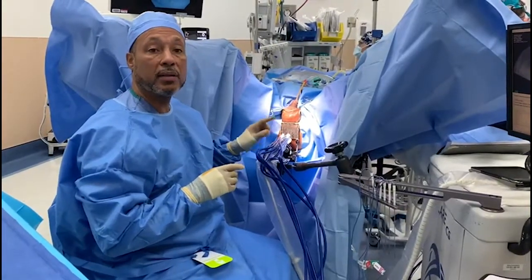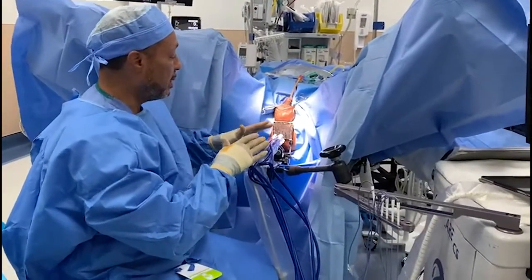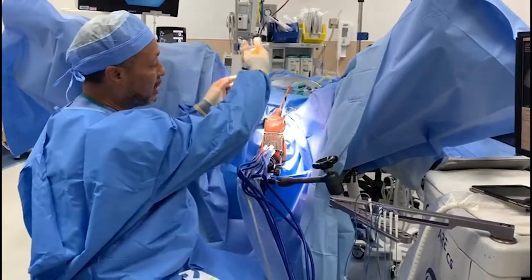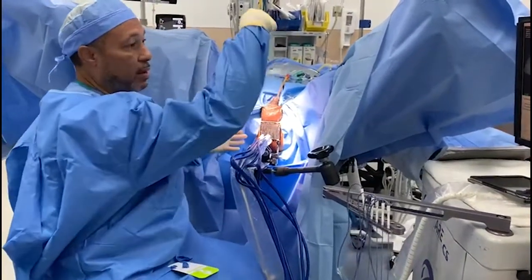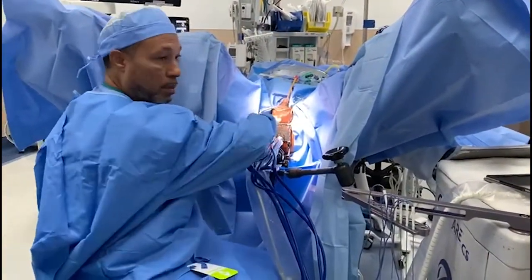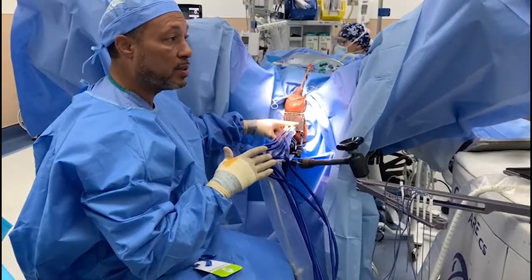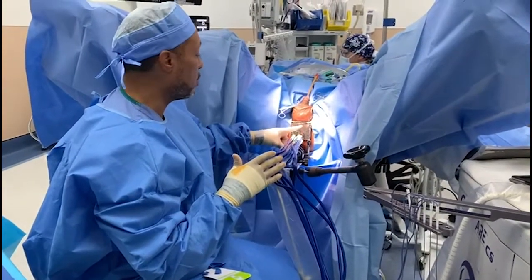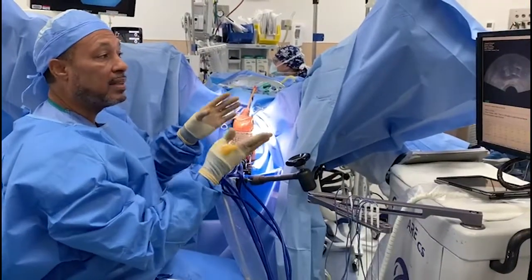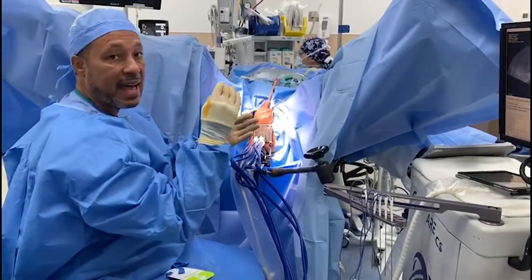With the Endocare system, I place the probes freehand through the grid. You can actually use a Bookwalter retractor and hang them free if you have an acute angle going into the prostate. But if you get this exaggerated lithotomy position, it'll be pretty much straight on. I loosely place each of the probes — there are six probes because we're doing a full cryo, three on each side. Then I'll go sagittal — I place them in the transverse and sagittal and then do the exact placements.